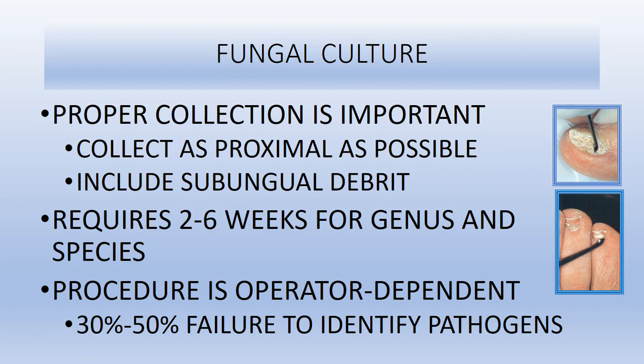It requires up to 6 weeks to get back results, however, for genus and species. And again, if we don't obtain proper culturing specimens, and if we don't transport these specimens in a relatively expeditious manner, there's a high incidence of false negative results.